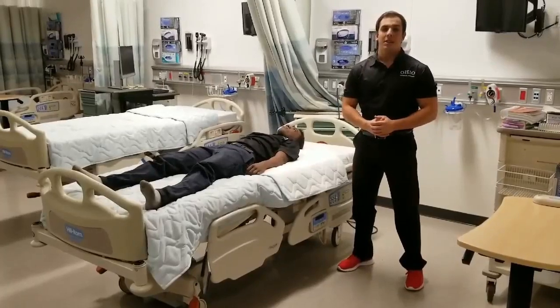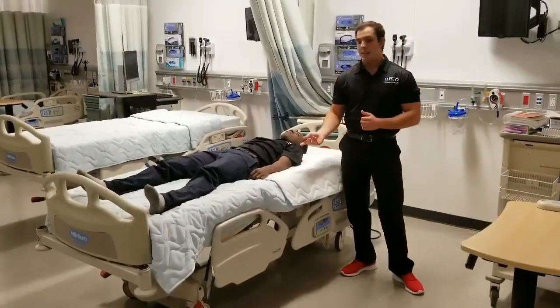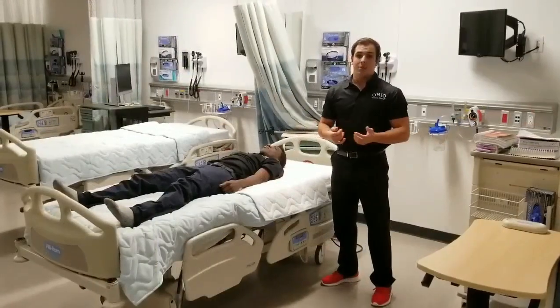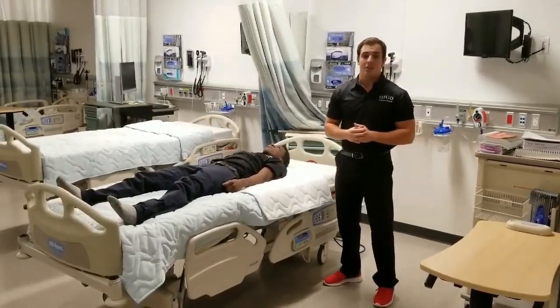Hello, my name is Austin, and today I will teach you how to transfer a patient laying in the supine position to sitting upright at the edge of the bed using the long sitting technique, and then back down in the supine position as well. I will also demonstrate how to use the hospital bed to assist you during this transfer as well.